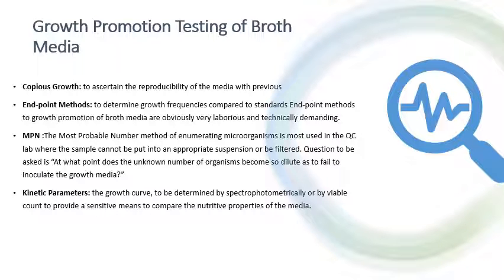So it is expected to have a growth curve that grows gradually and increases in height continuously, at least for the number of hours that is expected to be checked. And this will allow us to determine the viability, the supporting ingredients present in the broth during this time.